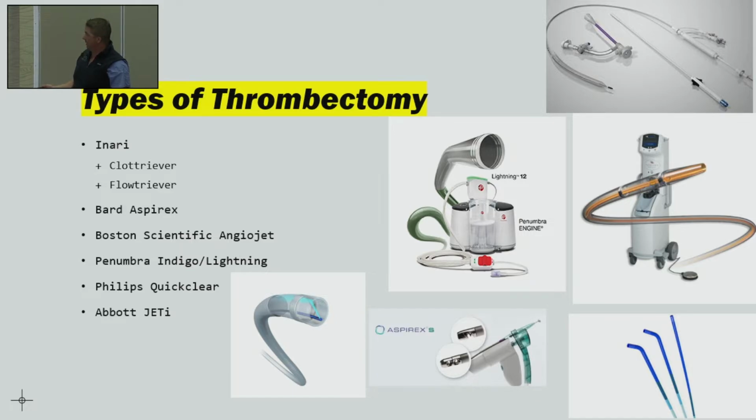This is an AngioJet. This actually has a catheter that is 8 French, and it creates a Venturi effect within the vessel and squirts out fluid to try and break up the clot and then subsequently suck it out. One thing that it also does is you can power inject TPA into the clot too and let it percolate to further break it up.